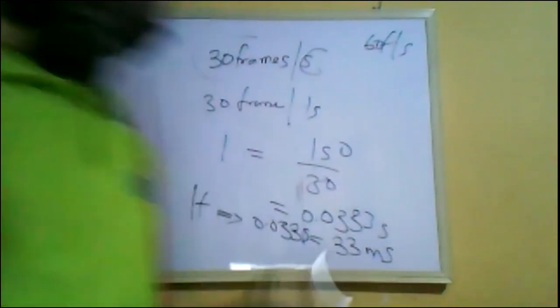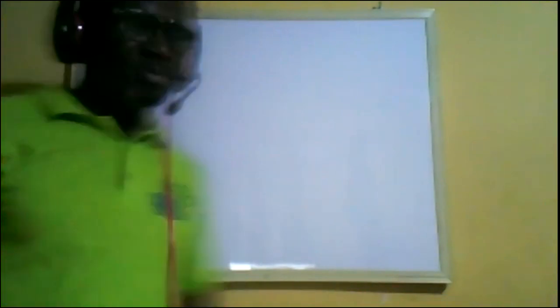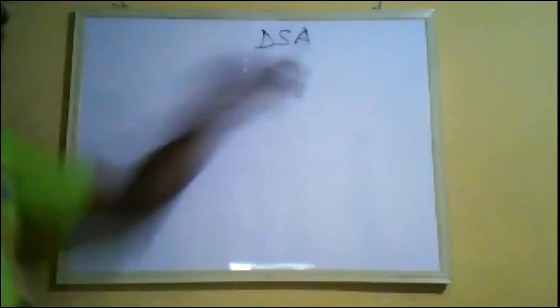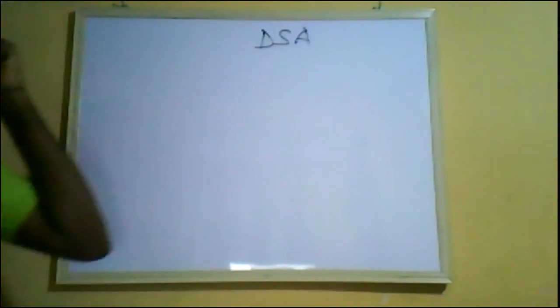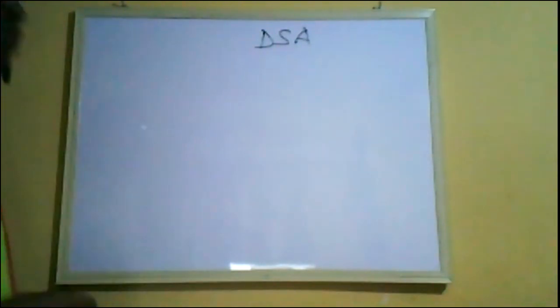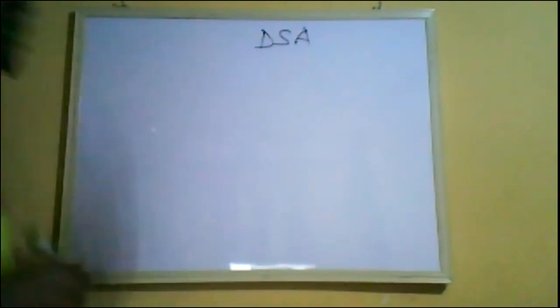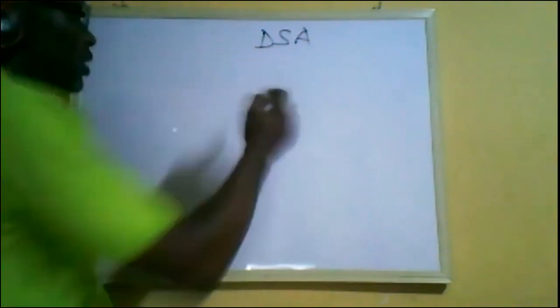During the road mapping, road mapping I think is mostly used in DSA, digital subtraction angiography, whereby all the other vessels and tissues have been subtracted. We are just left with the blood vessels and so on. So during road mapping, all we need to do is have an overlay of, let's say, this is the vessel.